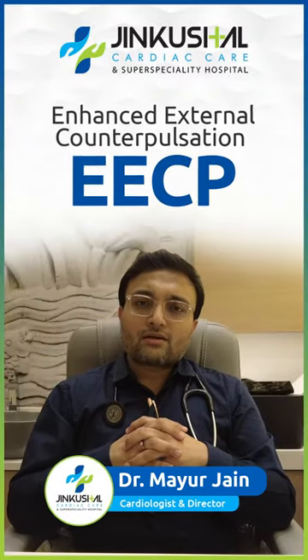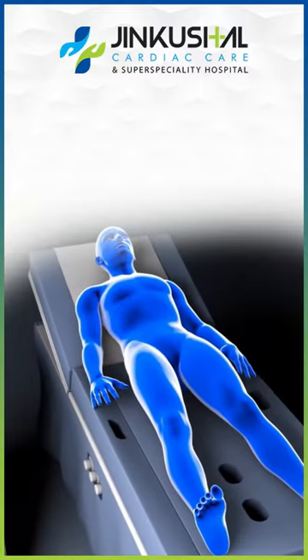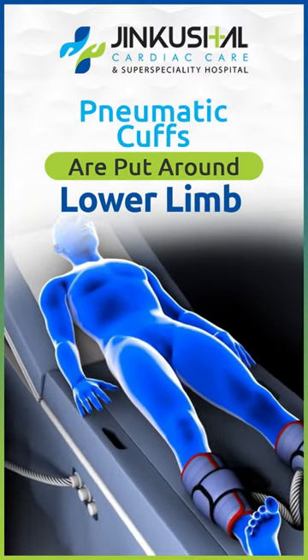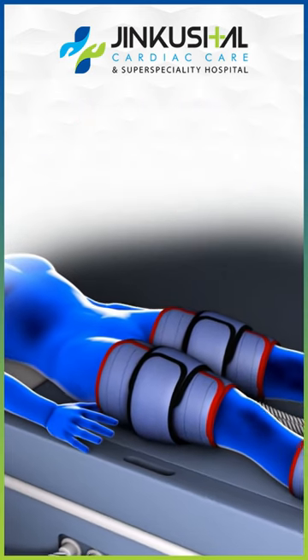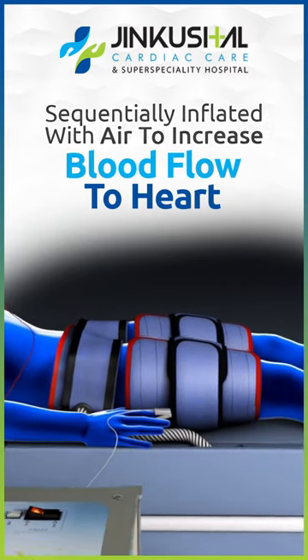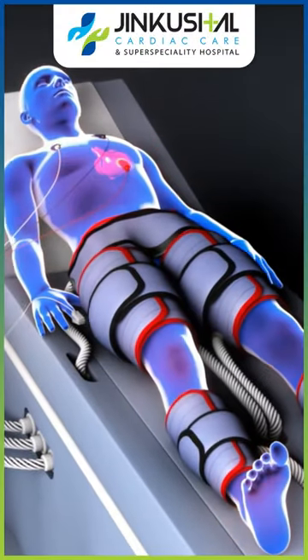EECP is Enhanced External Counter-Pulsation. It's basically a very simple method where we put three pneumatic cuffs — similar to BP cuffs — one on the lower limb, one on the thighs, and one on the buttocks, and it is sequentially inflated to increase the blood flow towards the heart.